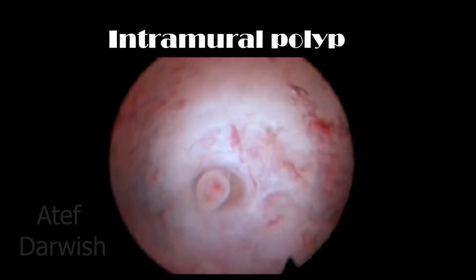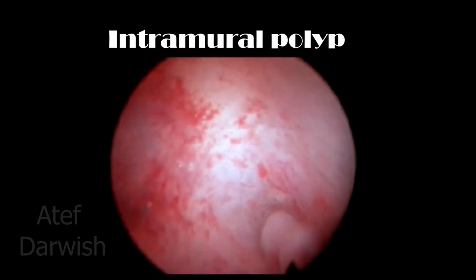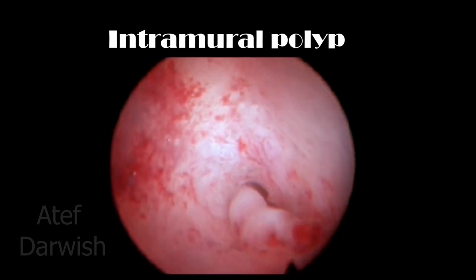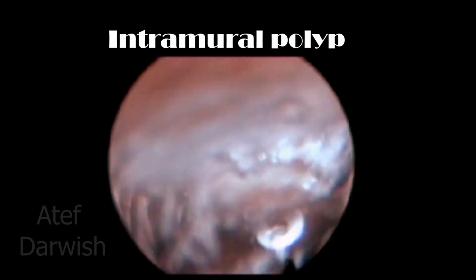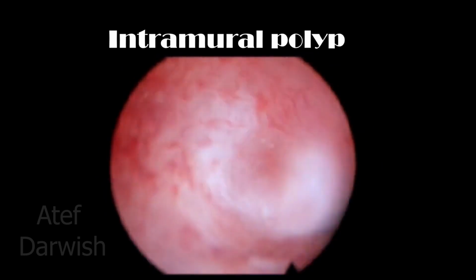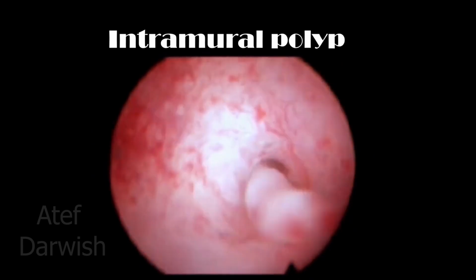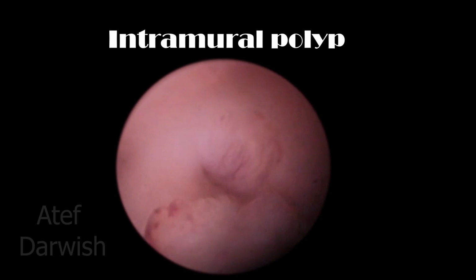Here you can see a polyp coming from the pinhole dark spot of the Darwish triad, and this polyp is not an endometrial cavity polyp. It's coming from the triad and protruding inside the endometrial cavity, and it needs fine and delicate instrumentation to excise it. The standard hysteroscopic scissors or resectoscope are not recommended for such a case.